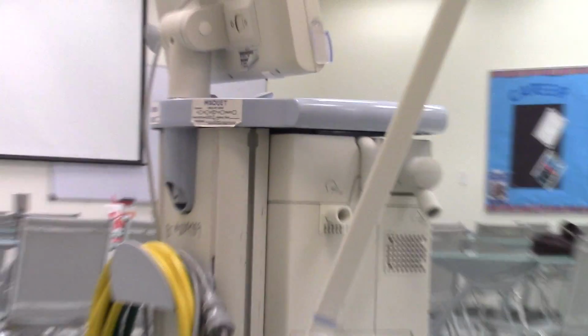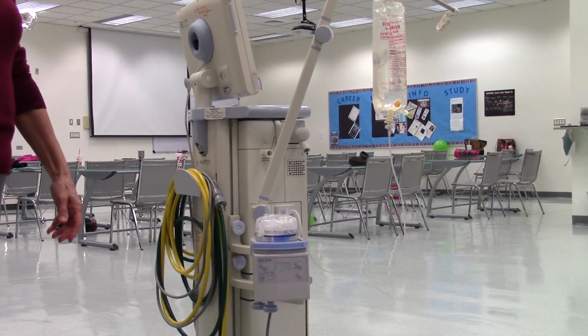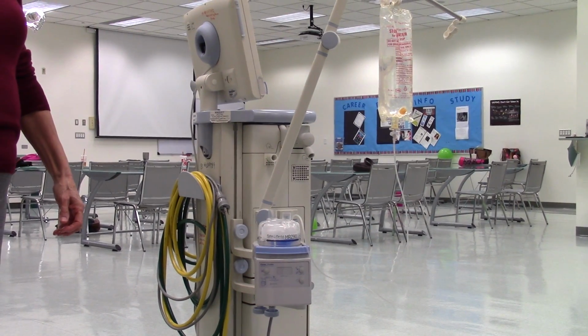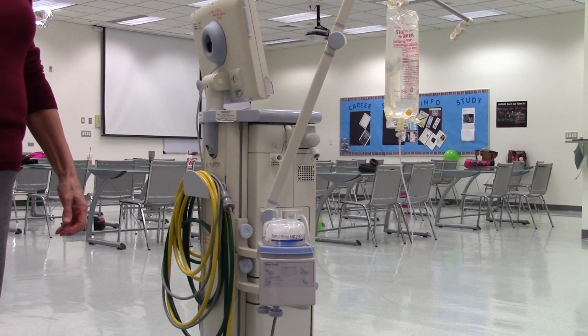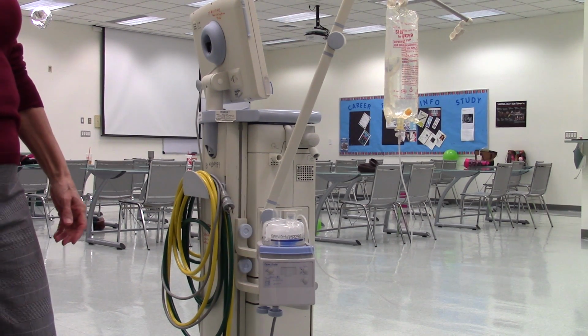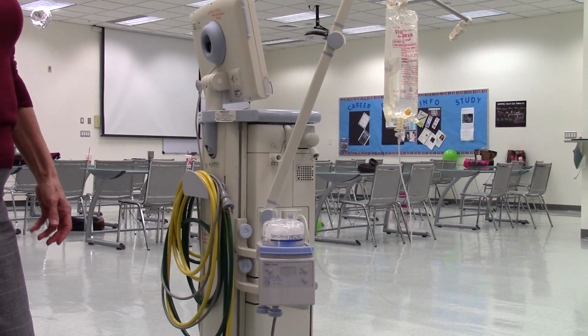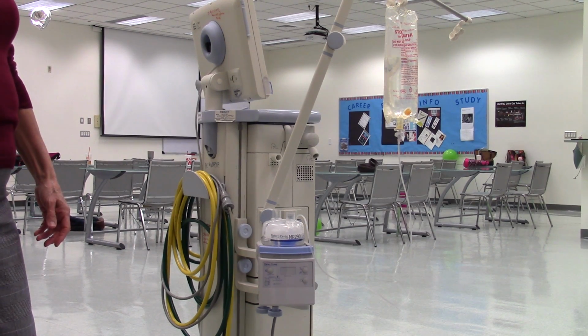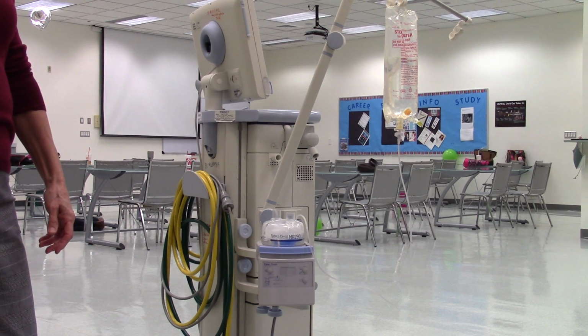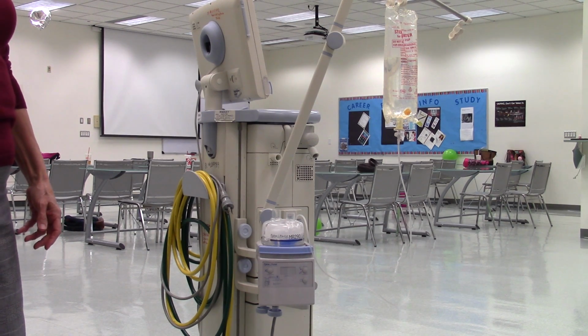Nice. It says, as water fills the chamber, it will stop filling when the bottom of the chamber is covered with water. What causes the water to stop filling? You guys have to answer that. The float. The blue float? Yes. The blue float. That's what stops the water from filling up too much. Then it asks, what is the purpose of the black line in the water chamber? That's the fill line. The fill line, yeah.